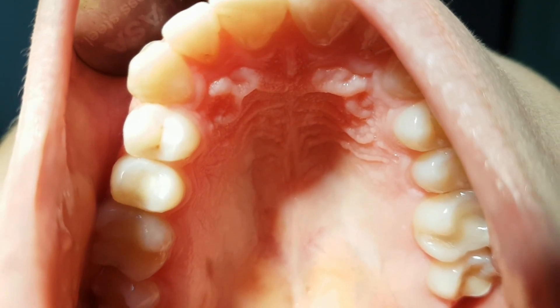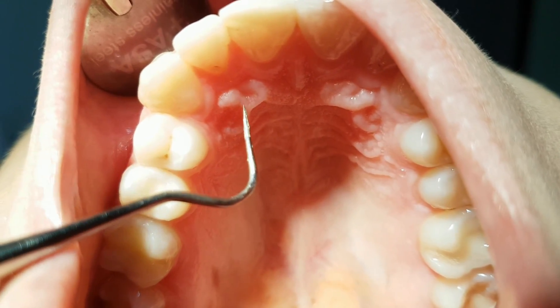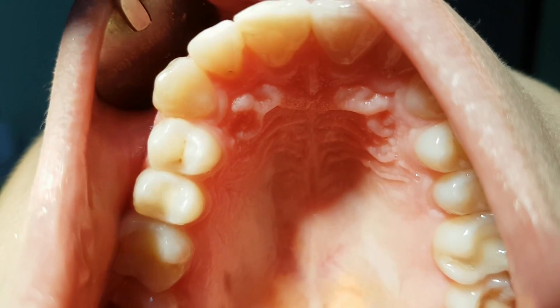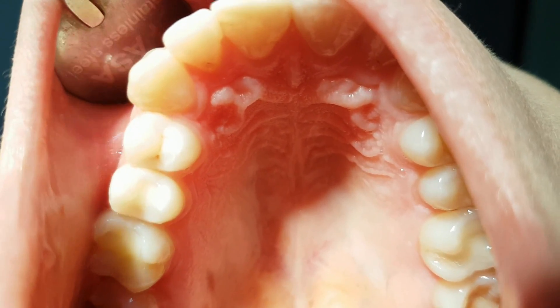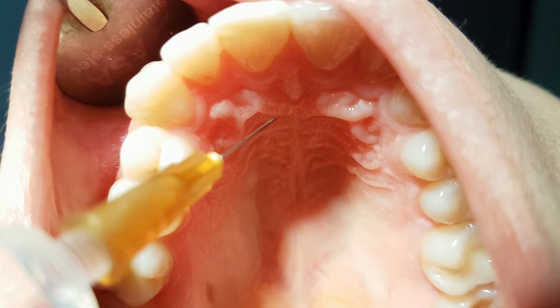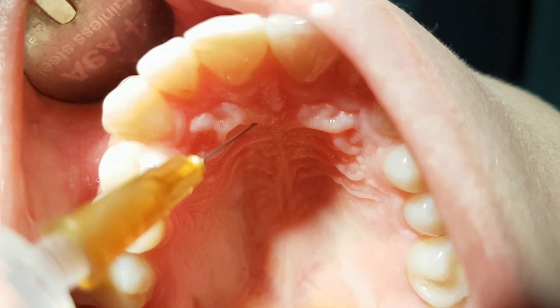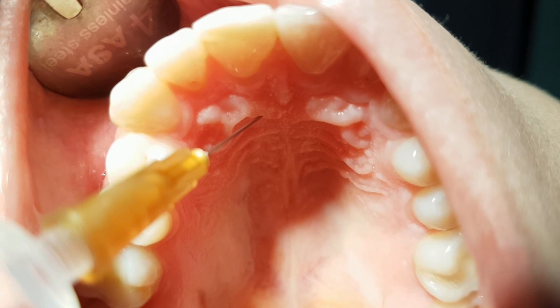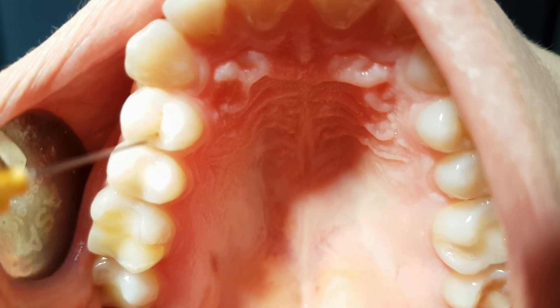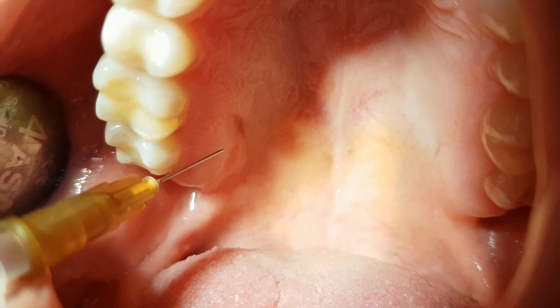When we apply anesthesia in the palatum, we also apply it at the level of the foramen apicale of every tooth, because the tissue here is more compact. A complication we have to avoid is the needle separating itself from the syringe during application. We use this technique for every tooth separately.